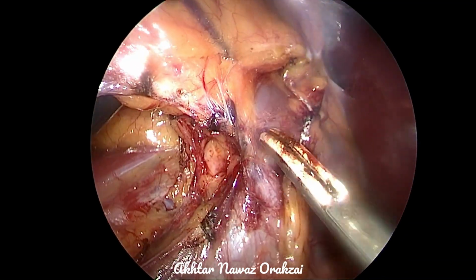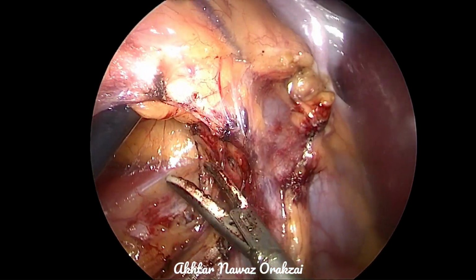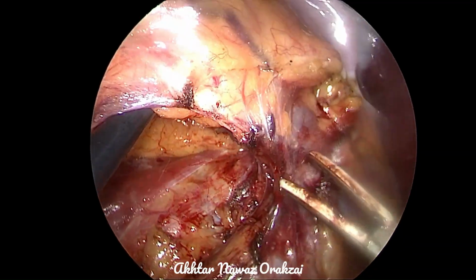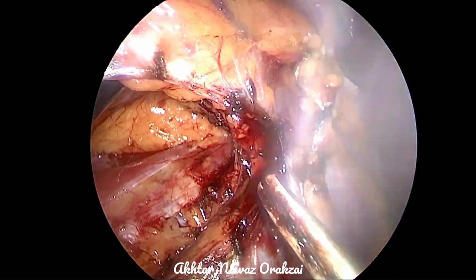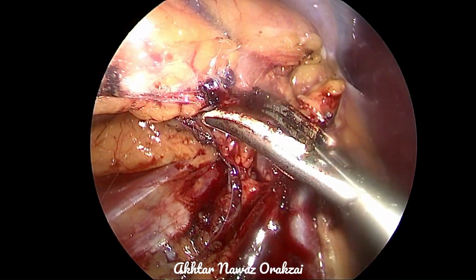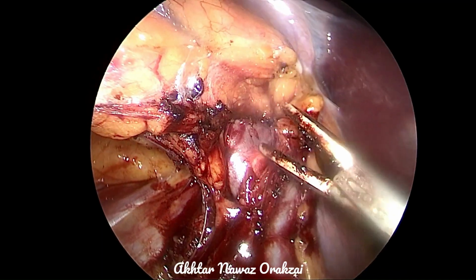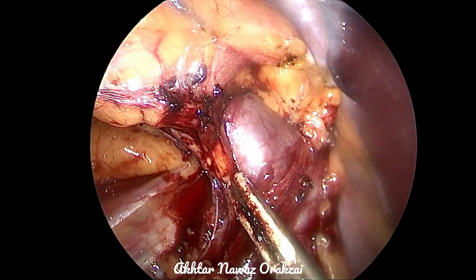As colon is already mobilized, duodenum is mobilized, the liver has been retracted, and dissecting along the lateral aspect of the inferior vena cava, we have gone to dissect and see the renal vein. So further dissecting and cleaning the renal vein now. On the CT, we have seen that the artery is located just posterior to the vein along its inferior border. So we consider ourselves to be lucky in that at least the artery is in the usual location.